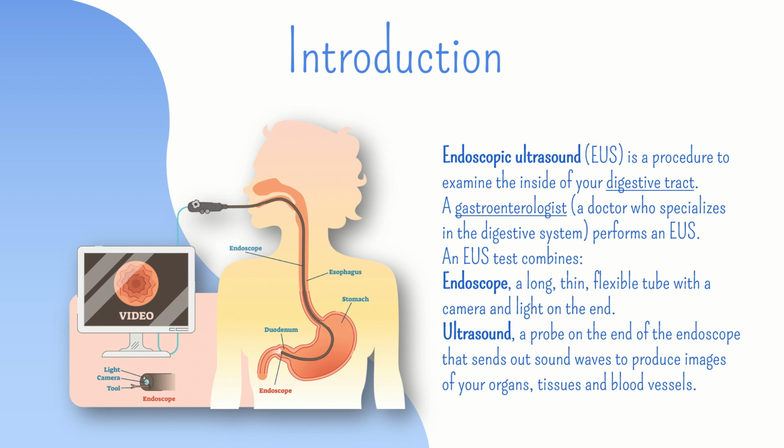Who needs this endoscopic ultrasound system? This is needed to evaluate or diagnose abdominal pain or chest pain, or if there are any cancers of different organs present in the digestive tract, or if there are any digestive tract problems such as inflammatory bowel disease, or if there are any stones or lung diseases, lung cancer, or any pancreatic diseases or swallowing disorders.